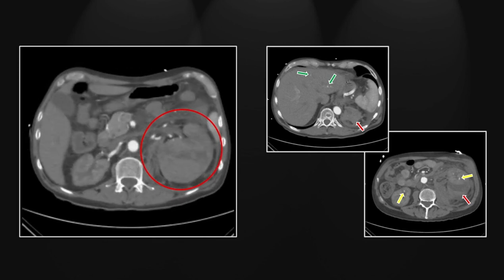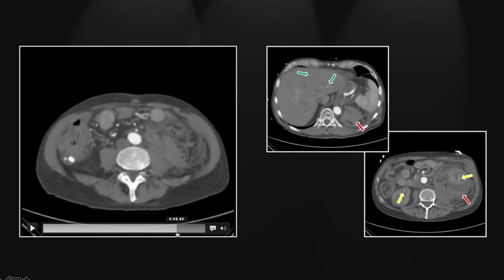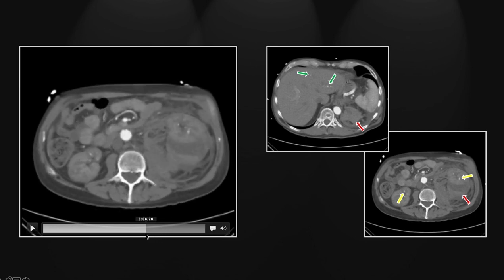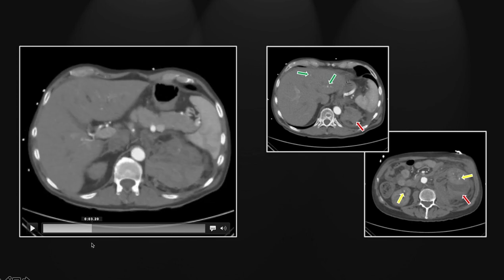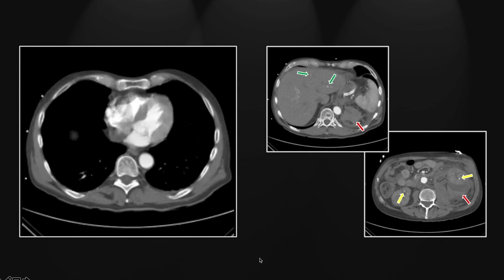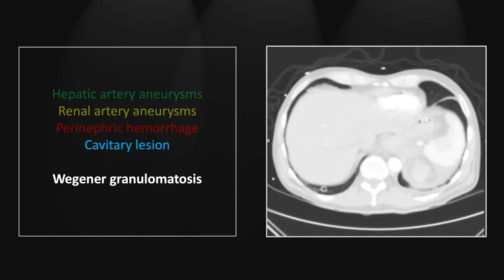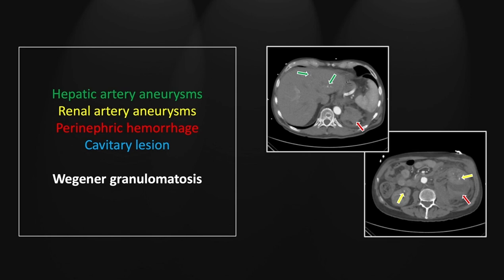Here is that left perinephric hemorrhage with layering density. Then going back up through these, appreciate those small foci of contrast enhancement within the kidneys and also within the liver, consistent with arterial aneurysms. So hepatic and renal artery aneurysms with active extravasation, most likely related to a left renal artery aneurysm. What puts it all together? This cavitary lesion does — that little focus there allows you to confidently make the diagnosis of Wegener granulomatosis as the underlying pathology in this case.